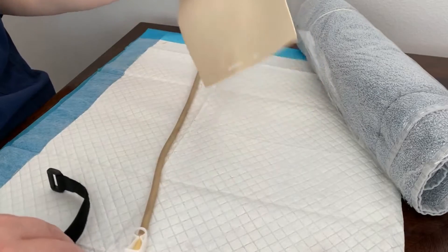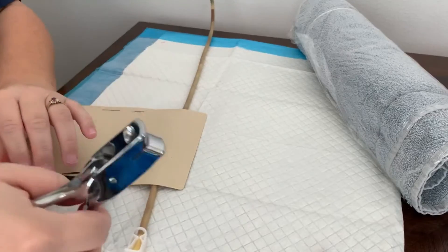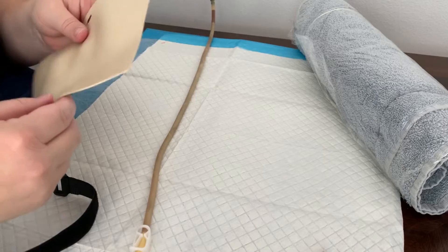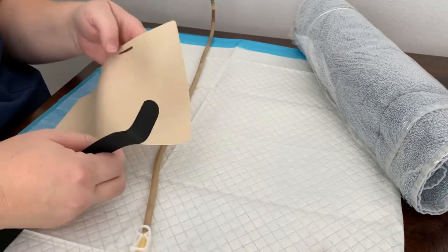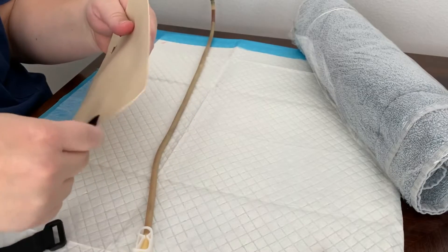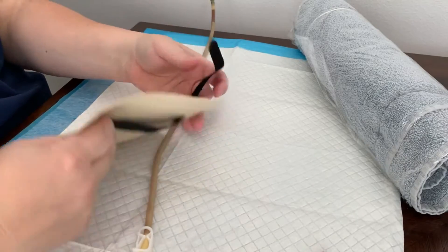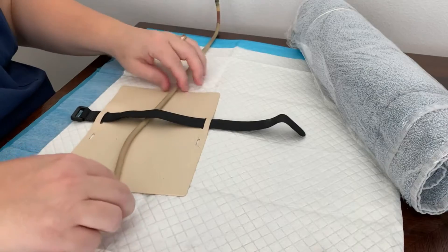Now we'll go ahead and get our skin situated. I have a little badge-holder hole-puncher and I punched my own holes in these. There are some on Amazon you can buy that already have the holes. This one is like a practice sheet so it's got extra holes in it, but you really just need one on each side. With our Velcro strap, we want to string it through these holes — keep the soft side toward the skin. Then to help secure our tubing, we're going to slide our tubing underneath there in the back, and that's going to help hold it in place.